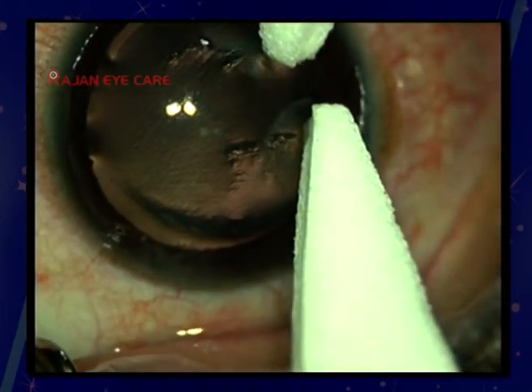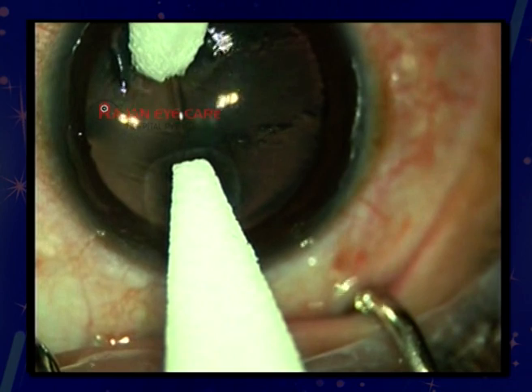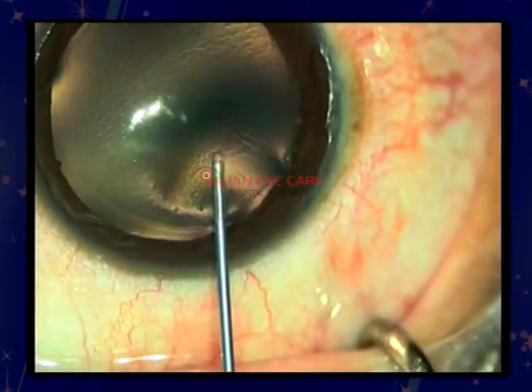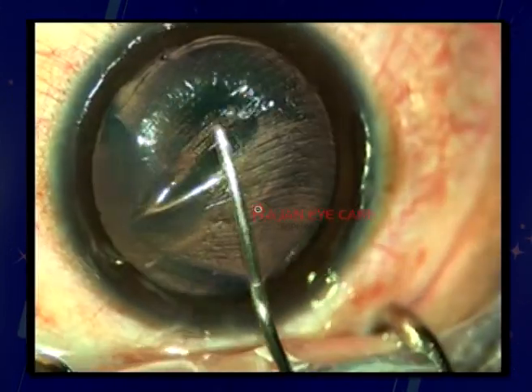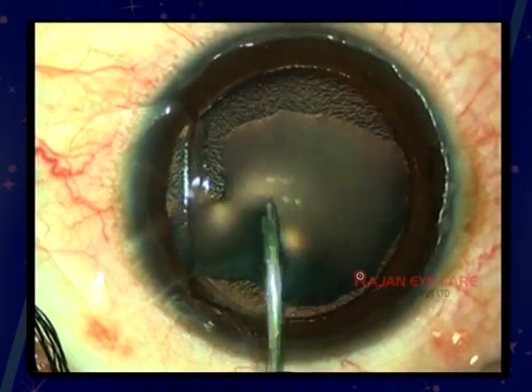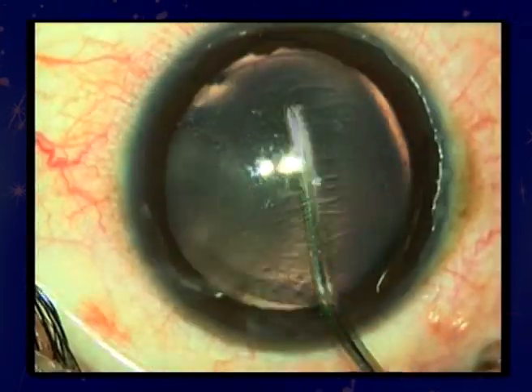Stretching the striae is done using two dry merosal sponges perpendicular to the direction of the striae. The flap is replaced after completely washing the interface.